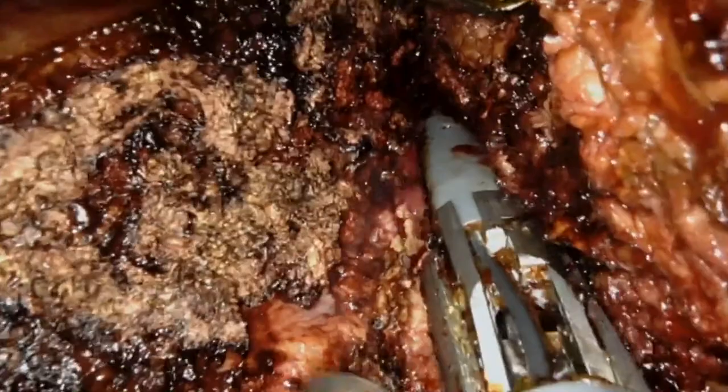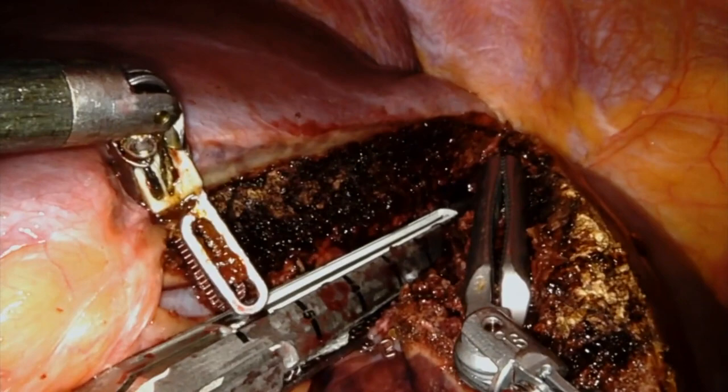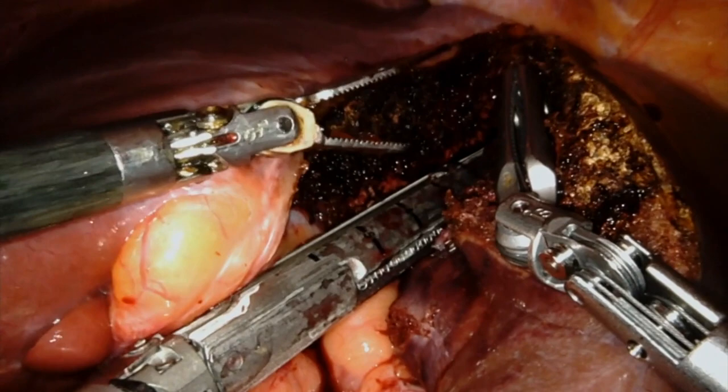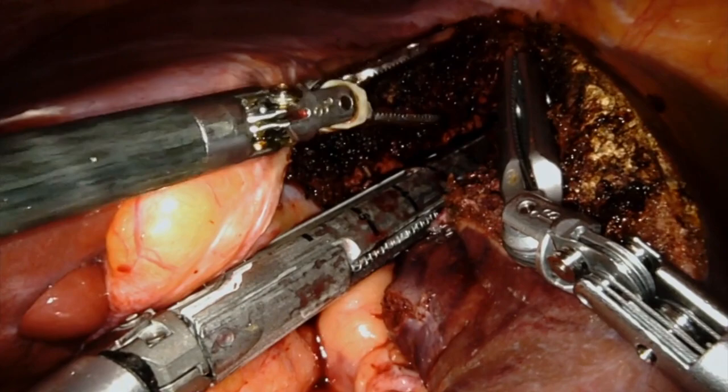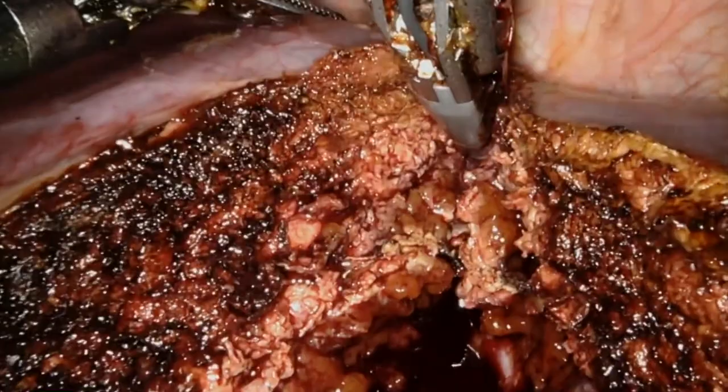Once we were down to the base of the umbilical vein, the bulldogs were removed and we utilized a laparoscopic linear vascular stapler to transect the portal pedicle going to segment 2 and 3, including the pedicle, in an en-bloc fashion. This was done with a 60 millimeter laparoscopic linear stapler. The stapling was done along the arantius ligament heading toward the stump of the left hepatic vein, which was clearly visualized.